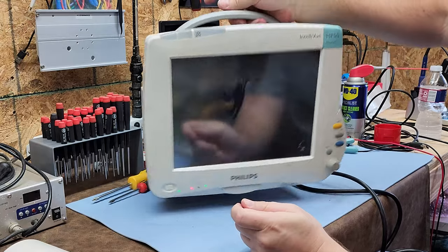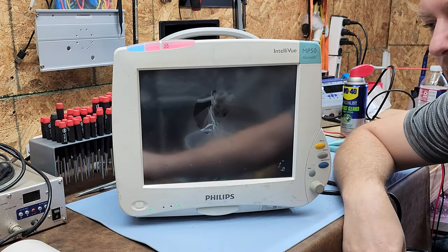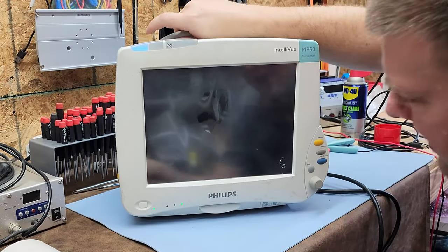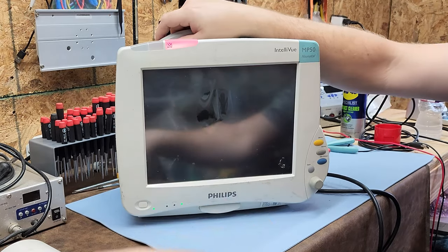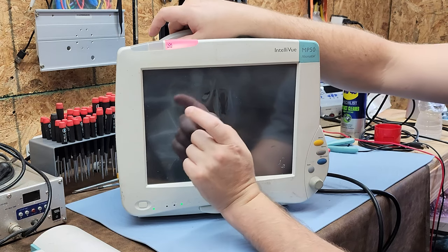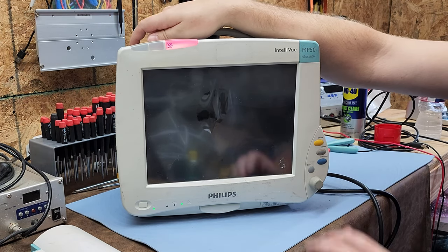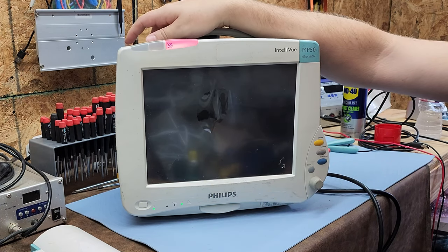This unit is basically a computer with minimum functionality without the module. Let's power it on and see if it even works. A special thanks to the guys over at Relink Medical — this is one of the devices they donated to the channel. I can tell right now it has a bad display, but that's fine — broken items have more value to me on this channel than working items.